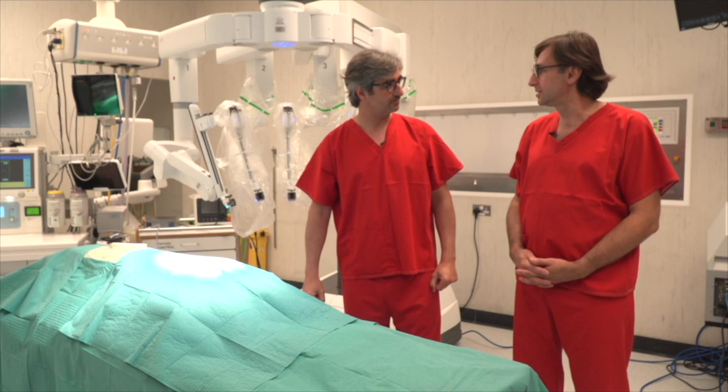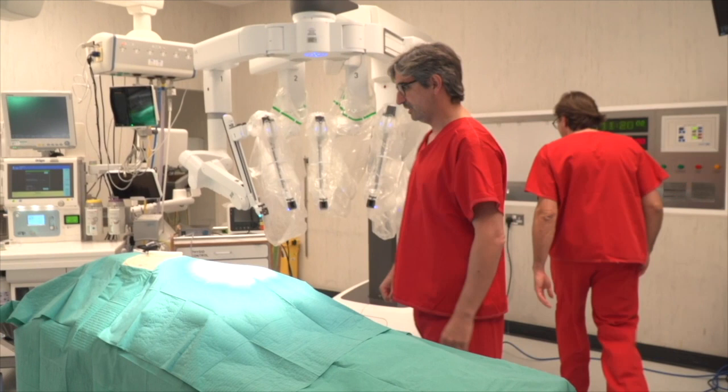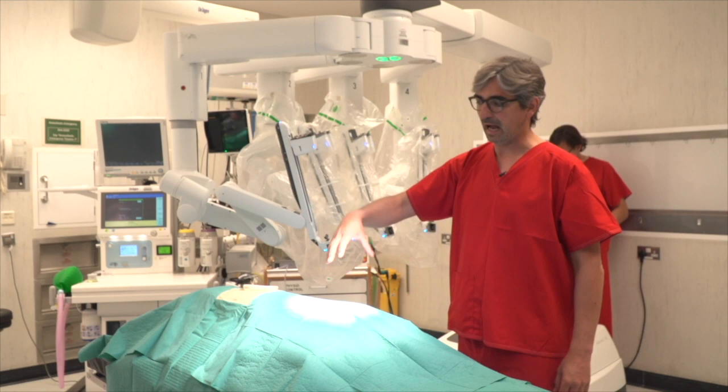You want to say something? No, hello, and I'm ready to position the robotic arms. Fantastic. Thank you. So let's drive. It doesn't matter if the robot is on the left or on the right, for example, for this right side case. Because this is a right upper, for example, we are on the right in the thorax, we need to cancel arm one.